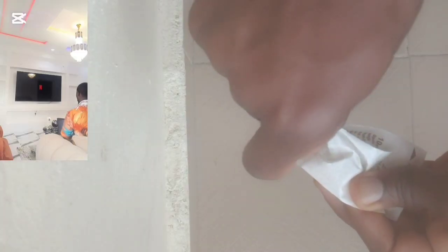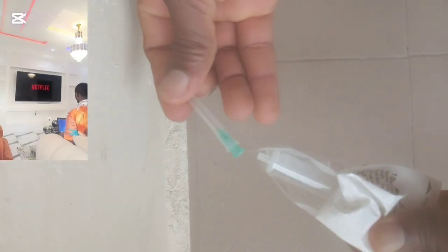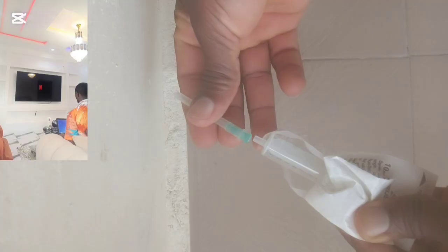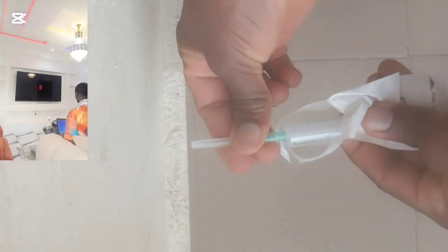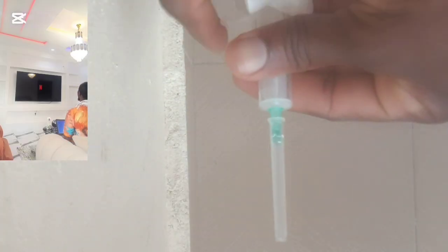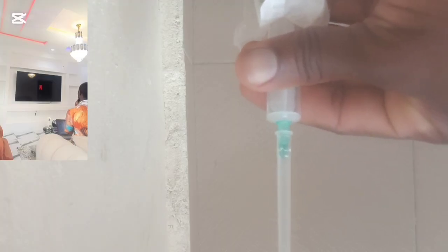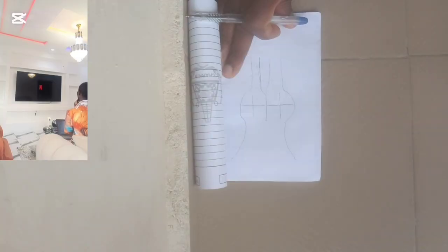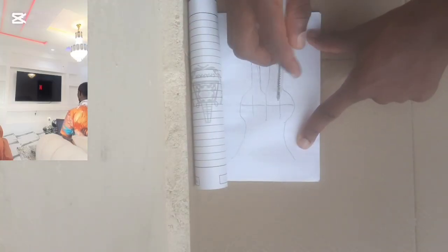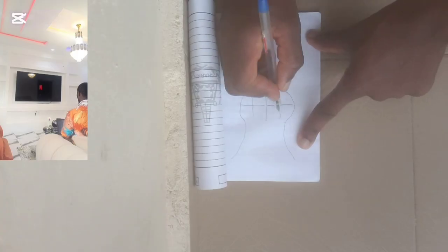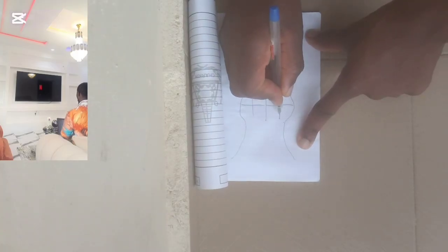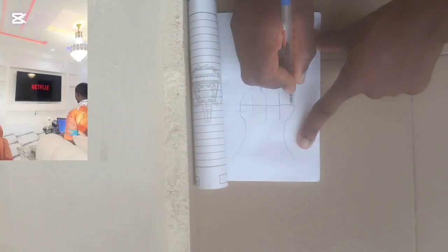So quickly you recap, after which then you get or look for your ampoule bottle and aspirate the medication.